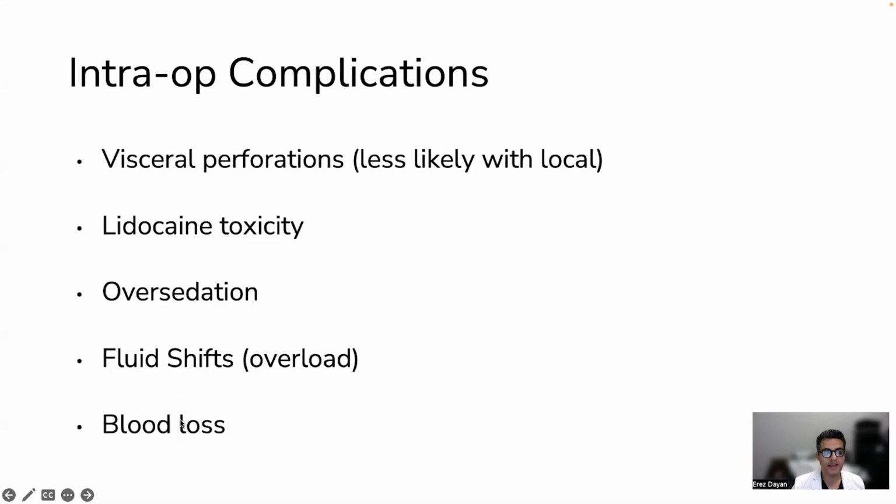And the other thing is you always want to assess your aspirate. Make sure that it looks yellowish. You don't want to be sucking out, frankly, bloody fluid. So if you give your tumescent enough time to allow the epinephrine to constrict the blood vessels, your aspirate should look kind of like applesauce, maybe with a little blood tinge, but it certainly shouldn't be frankly bloody. And if it is, you should just stop the procedure and either move to another area or inject more local anesthesia or just abort the procedure altogether if all you're getting is bloody aspirate.